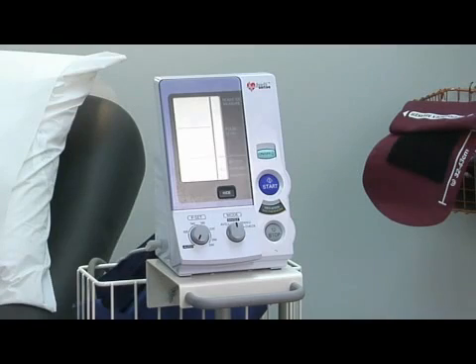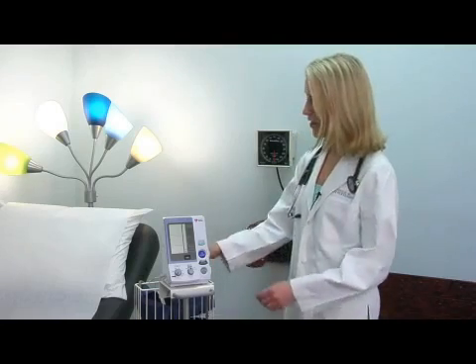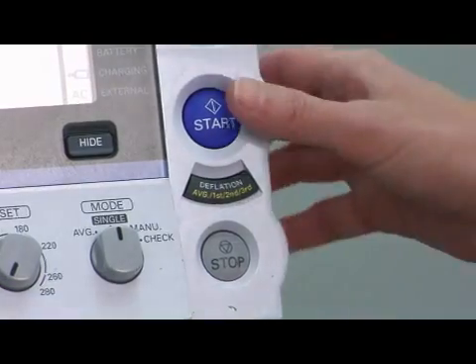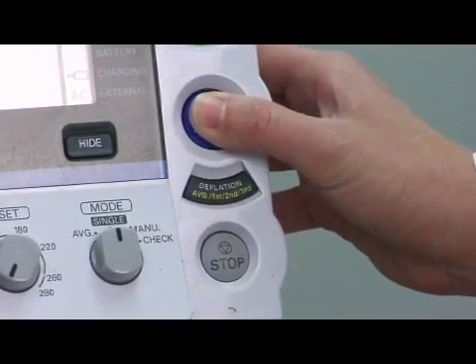Most people, when they have a home machine, it's very much like this one — an electronic device. These are much easier to use when you'd like to measure your blood pressure yourself. Generally, the cuffs have velcro that you can close over your arm with one hand, and all you have to do to measure the blood pressure is to press a button. That's all you need to do.